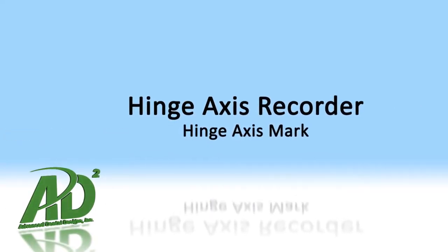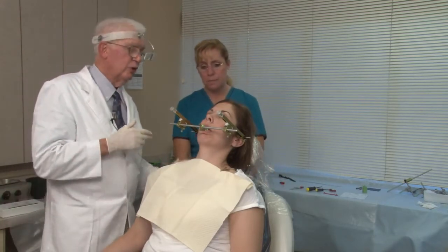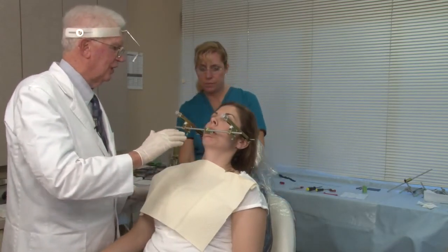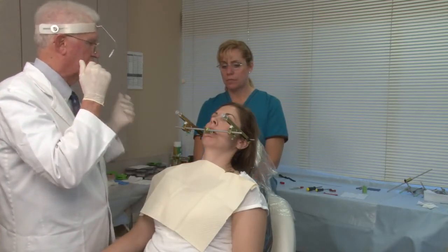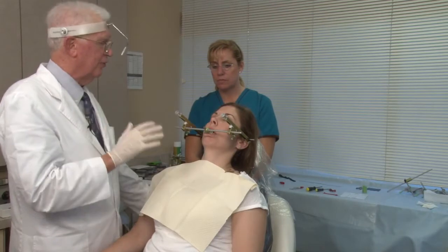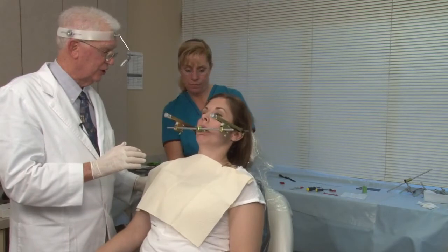The first thing I have to do is I have to establish a standard position for putting the axis point onto the face and at the same time eventually taking that measurement off of the face. If you have a patient laying back like this, lay her back some, move her back. If you have a patient laying back some and you put a mark on the skin and then you set the patient up, that mark changes because of gravity. The skin will move a little bit because of gravity. And so your hinge axis mark is not correct. So you have to do a standardized position every time. And that standardized position that we accept is that we set the patient up totally, so move the back of the chair up completely straight, as far as it'll go.